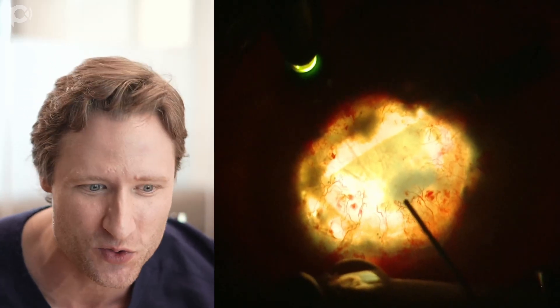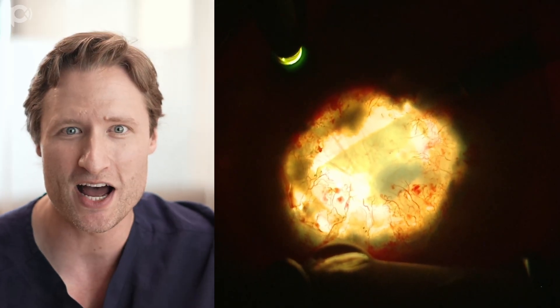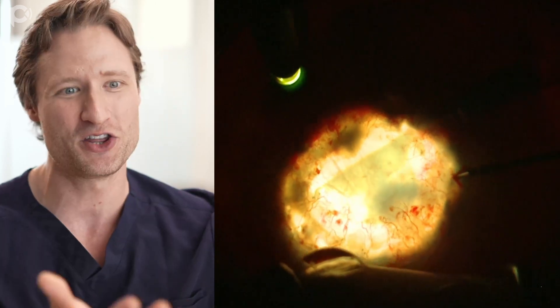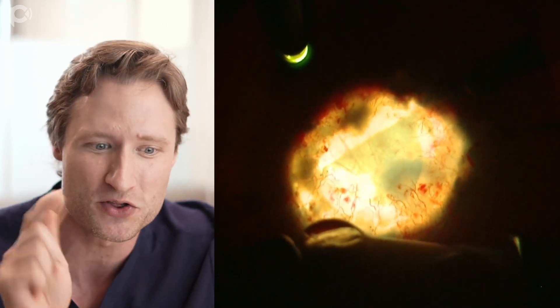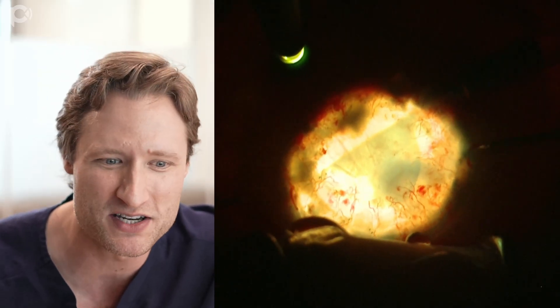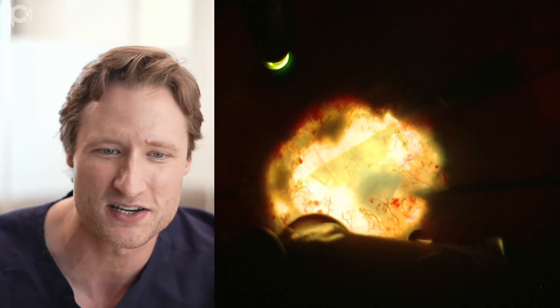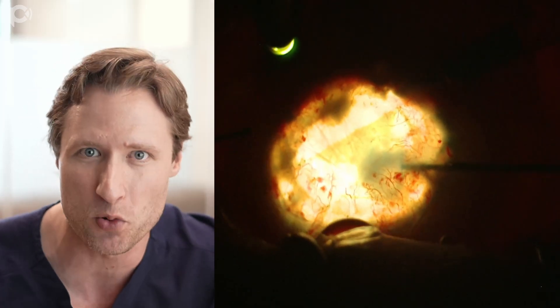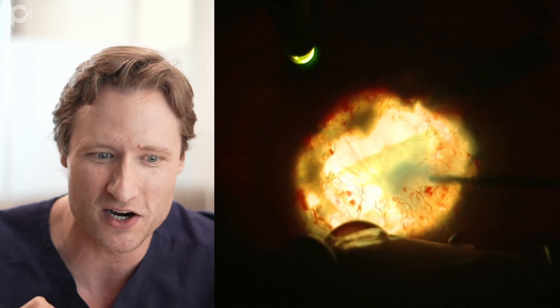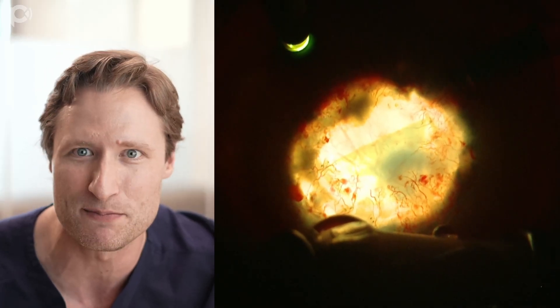I'm evaluating my options - could I go in through a paracentesis, or use the main wound? What I worry about with the main wound is that with the anterior chamber maintainer running, I might flush the graft out through it if I'm using it to poke the graft edges open. The paracenteses are so much more fiddly - you get iris locking, and it's difficult to find them with the microscope light off. At this point my primary concern is not to mess up the success I've already achieved. I'm holding the graft with coaxial forceps, trying to get that edge to flip with taps on the corneal surface, and that's not working.